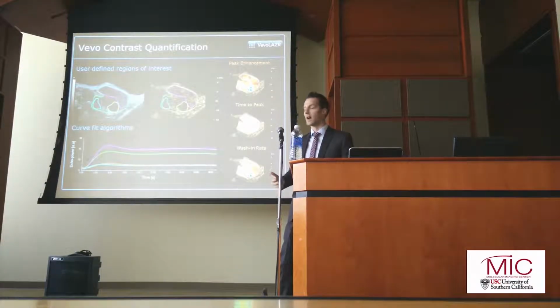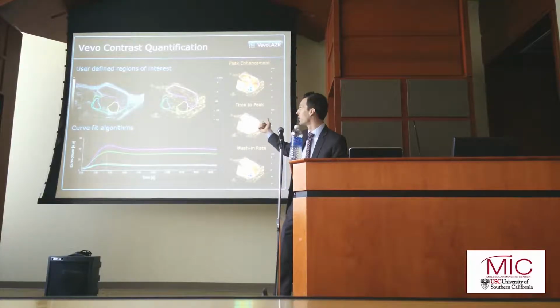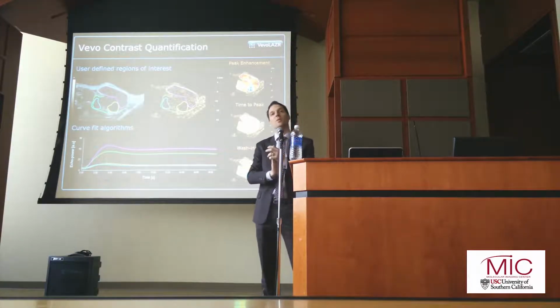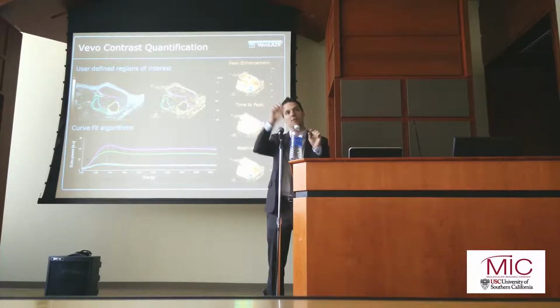On the analysis side, now I showed you earlier, this is actually that same tumor. It's a pancreatic tumor, an orthotopic pancreatic tumor, by the way. This is the same tumor that I showed you, that injection of microbubbles coming into the tumor. And we have this VevoCQ contrast quantification software which allows you to quantify this signal. So we have a whole bunch of data points for each region in that tumor.